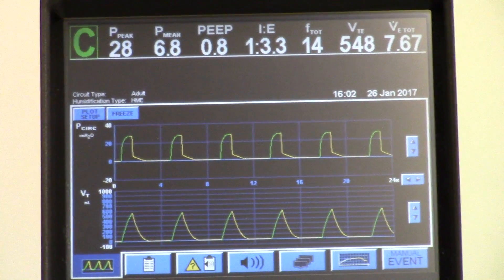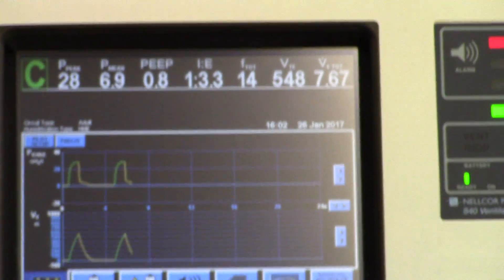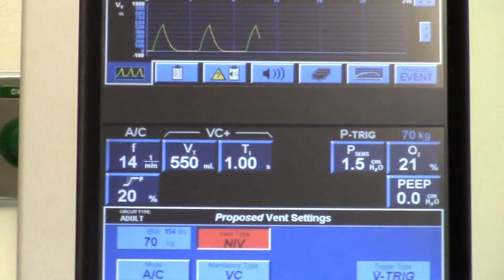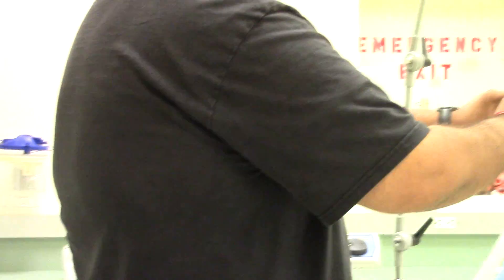We're actually going to have to change the settings because it's not going to be invasive anymore — it's going to be non-invasive.